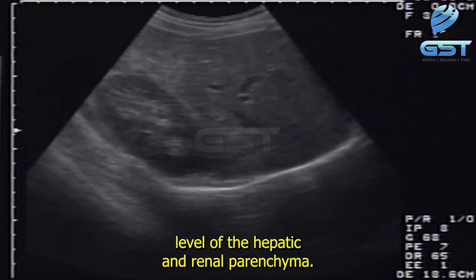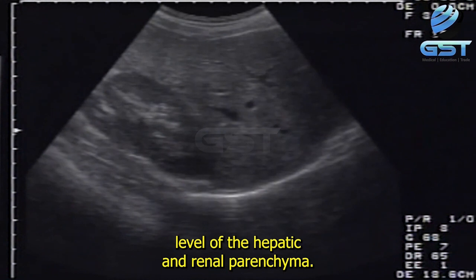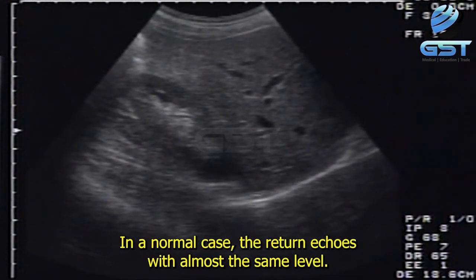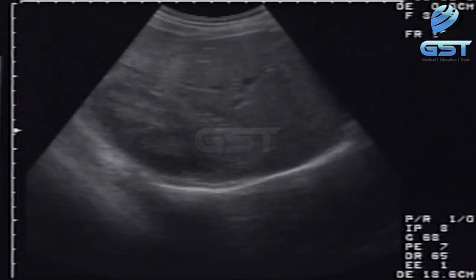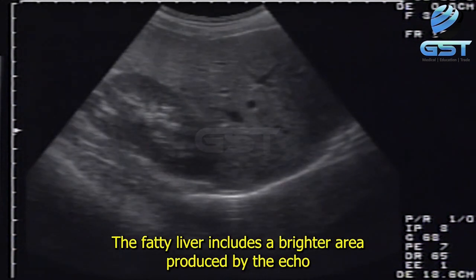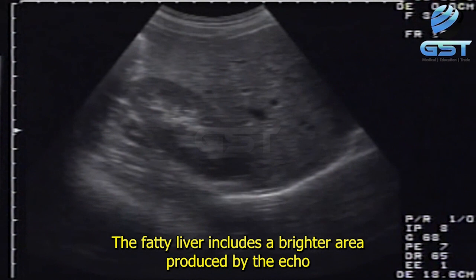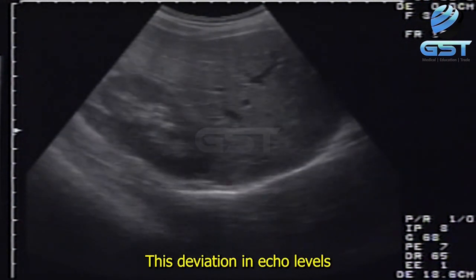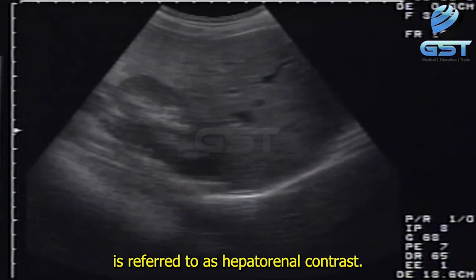Compare the echo level of the hepatic and renal parenchyma. In a normal case, they return echoes with almost the same level. The fatty liver includes a brighter area produced by the echo from the hepatic parenchyma. This deviation in echo levels is referred to as hepatorenal contrast.